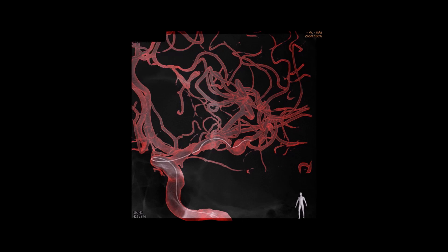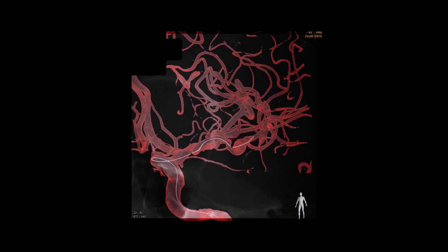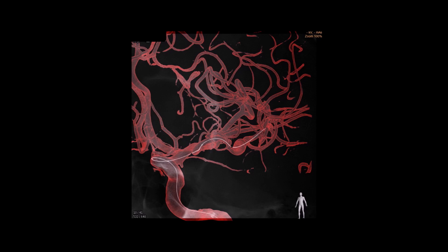A 3D angiogram roadmap allowed better vessel visualization for safer navigation to the distal temporal artery. A Synchro 0.014 microguide and a Headway 17 microcatheter were used.